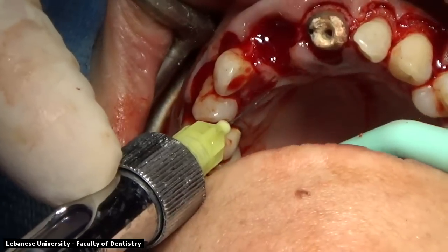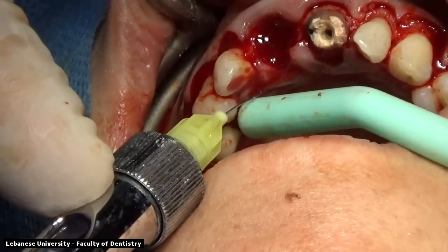Adding some anesthesia on the palatal to decrease the bleeding and create some vasoconstriction.